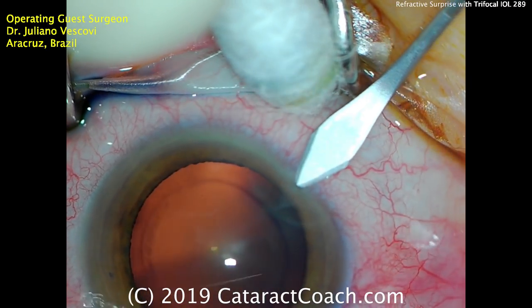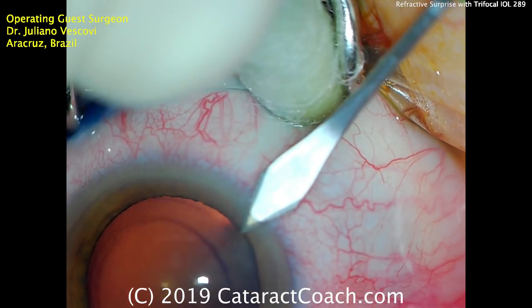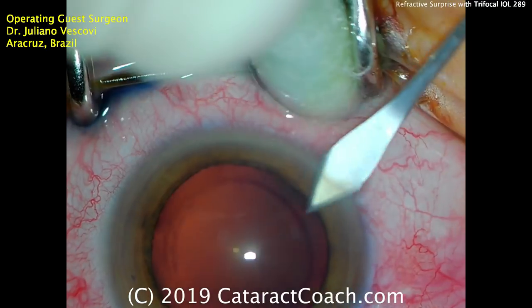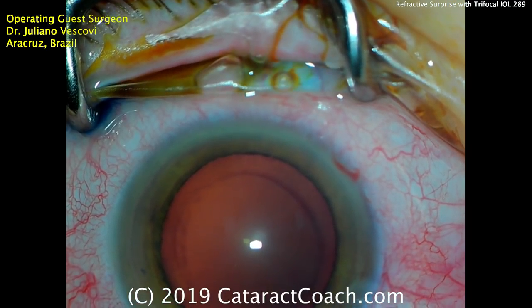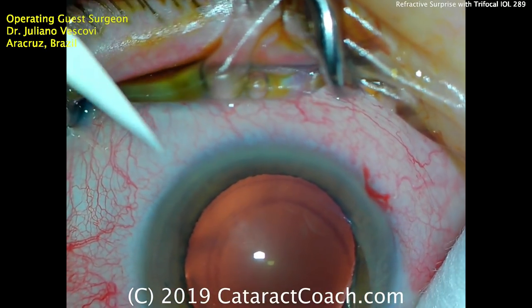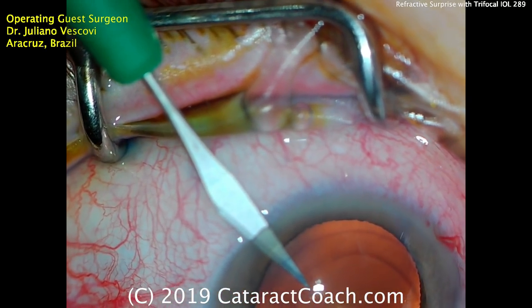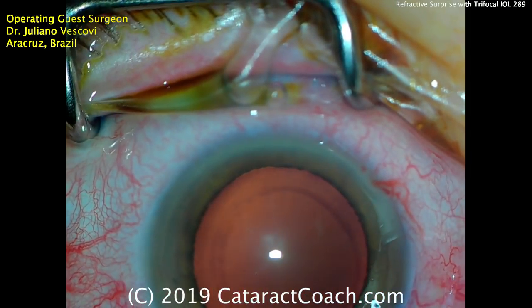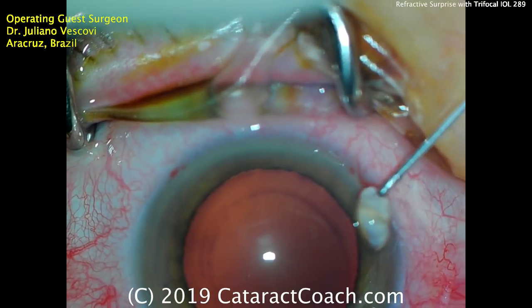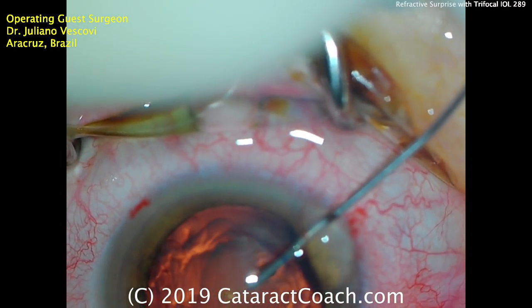Starting off the case here for cataract surgery, using the keratome to make a main incision at the limbus and the edge of the clear cornea. The limbal vessels have barely been nicked there — that's going to mean that incision will heal beautifully with great long-term stability. A paracentesis has been made as well. You can see that a stencil or mark has been used to outline the capsulorhexis.